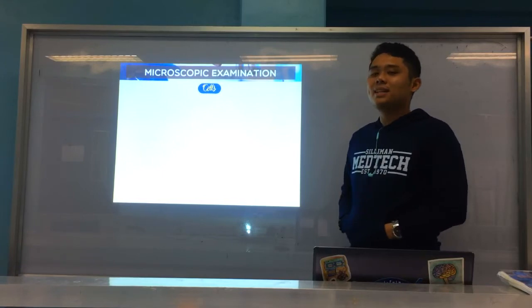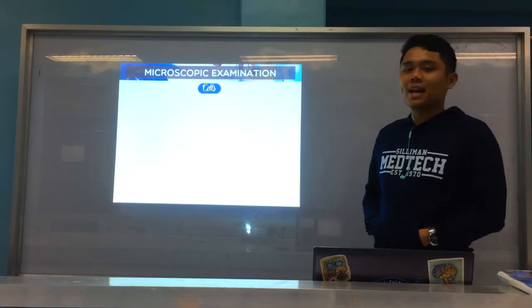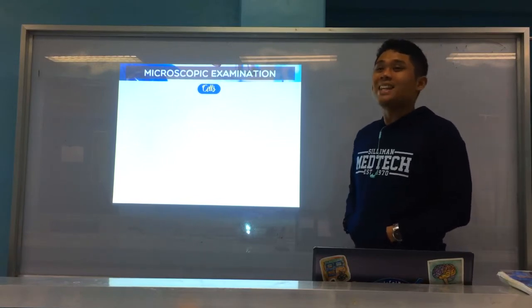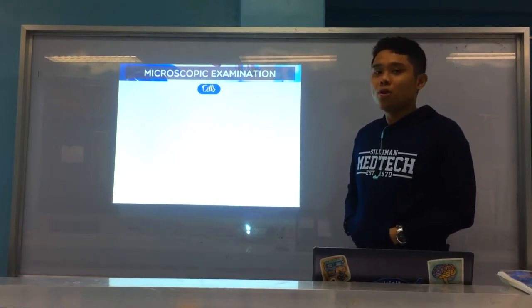Please don't forget: what is the volume of the sediment examined under the microscope for microscopic exam? 20 µL, or about 0.02 mL.